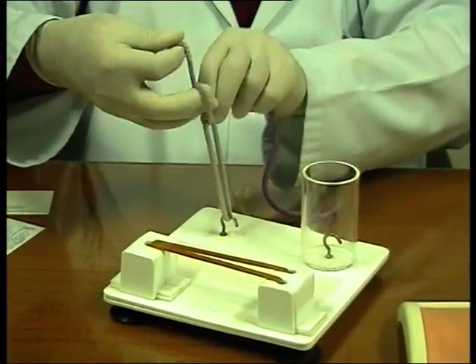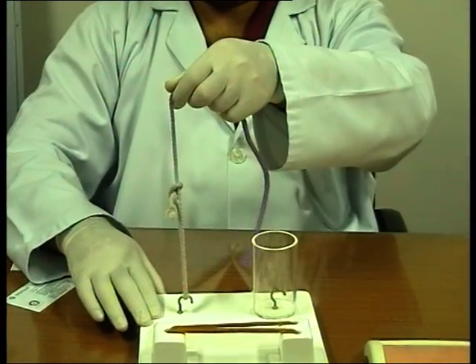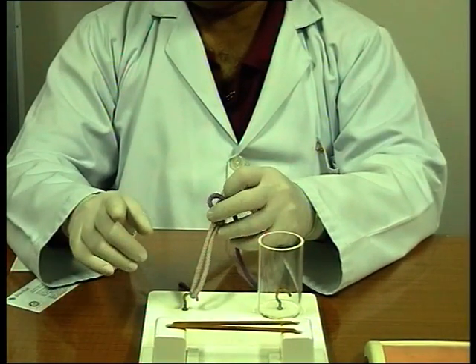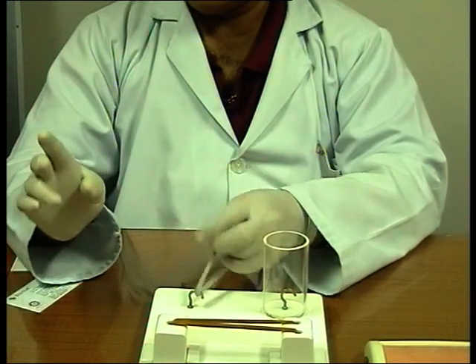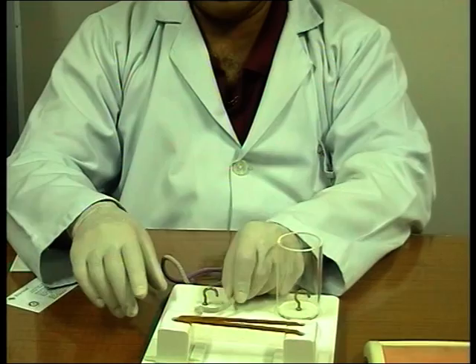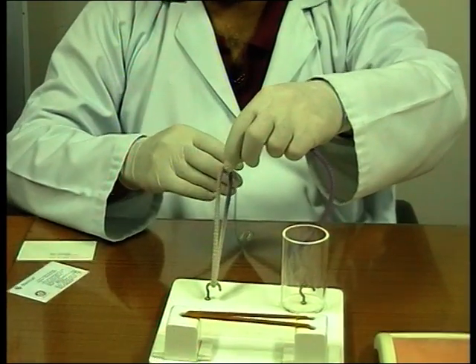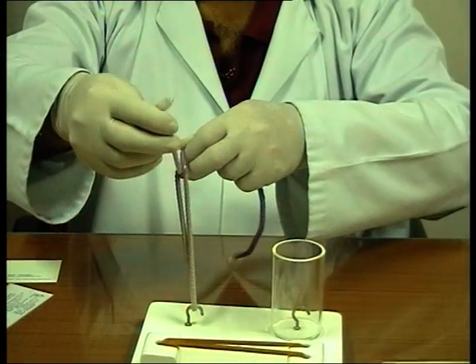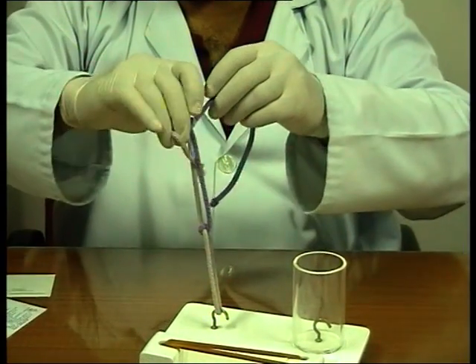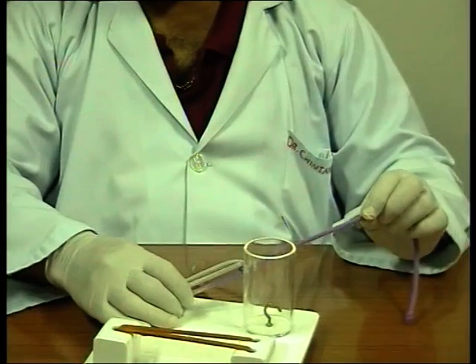Without crossing. Okay. If you understood the reef knot clearly, the reef knot without crossing is a slip knot. An easier way of putting it: this would be a reef, but I don't cross. And on the one, I put a middle after that. I've done everything alright except that I have not crossed. It will be a slip knot.